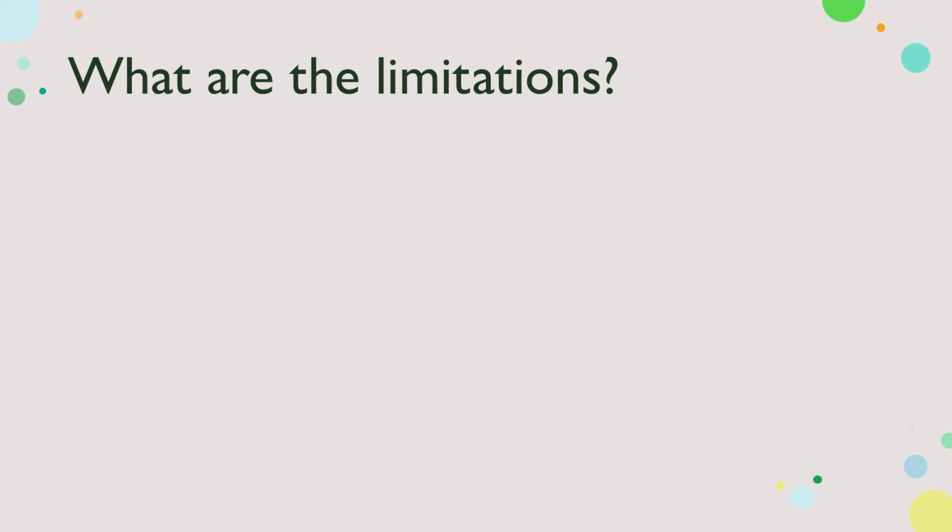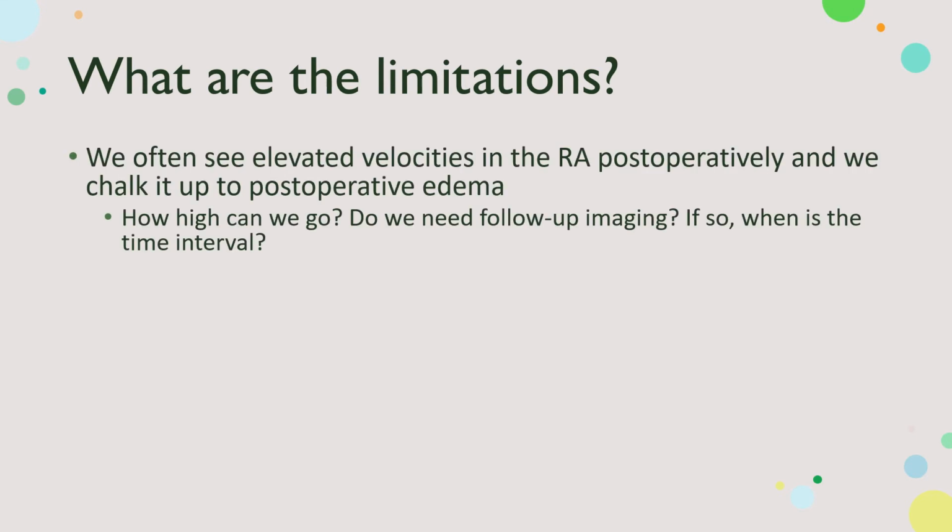So what are the limitations of us adopting this system? Well, we often see elevated velocities in the renal artery post-operatively, and we always chalk it up to post-op edema. Well, how can we go? Do we need follow-up imaging? And if so, when is the right time interval?